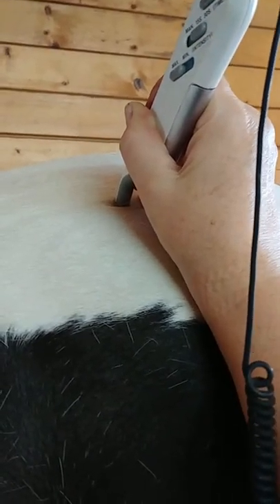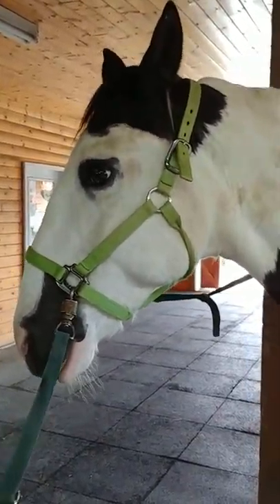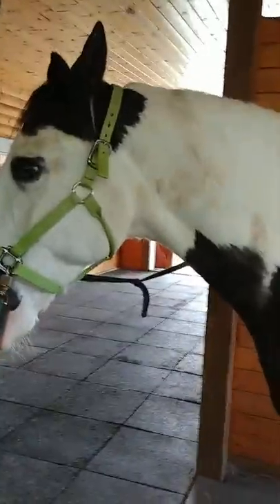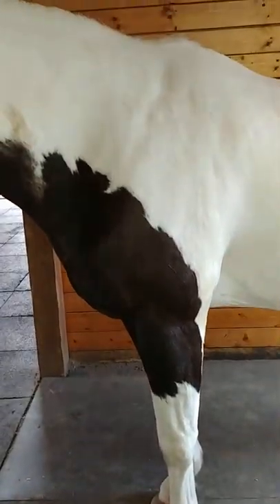The machine will find spots, and it's interesting because sometimes you'll get a very high pitch, which means it's an inflamed nerve. Other times you'll get a much lower pitch, which is what's happening with him. The low pitch is showing me that he's got nerve impingement in between muscle and sometimes in between bone, because when I'm running it and grounding it properly, I'm finding the pitch dropping quite a bit.